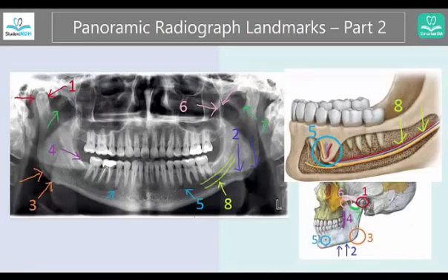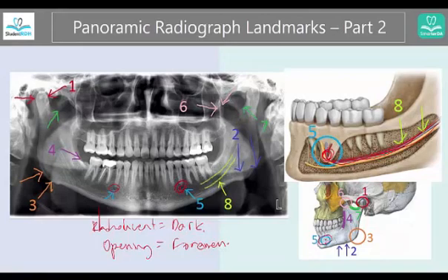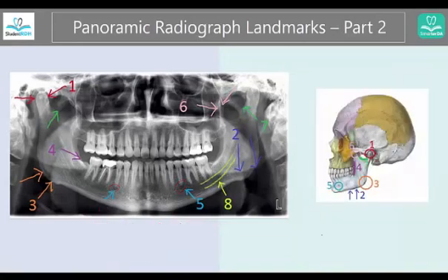Number five — I brought this special image because I wanted to show this first. Are those little dots a radiolucent area? Yes, they are darker because those are openings — also called foramina — and those are where the veins, blood vessels, and nerves come out of. Those areas are usually below the premolars, between the first and second premolar or just below the second premolar depending on the person's anatomy. If you want to do a mental block to anesthetize the front teeth on the outside only, this is where you would target.